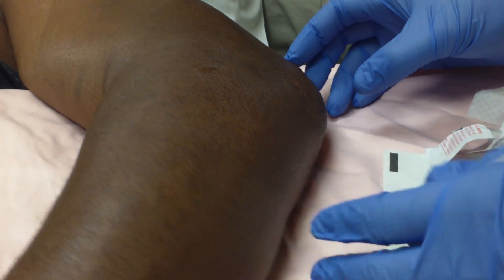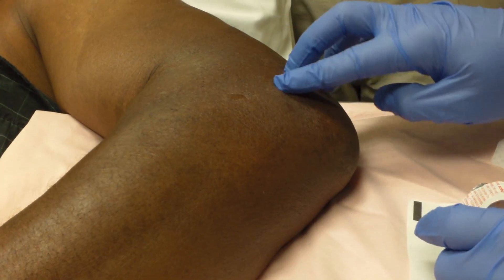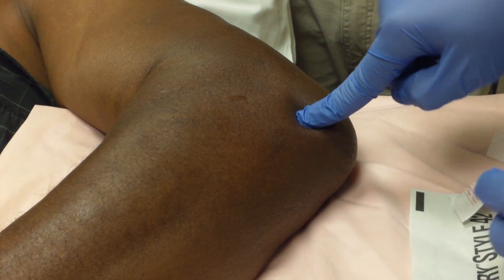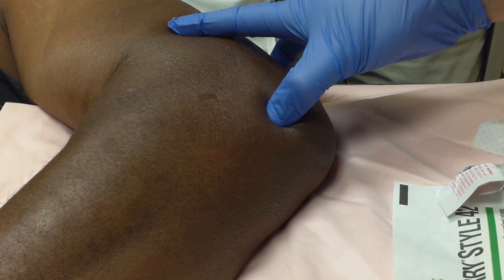What we're trying to do here is tap the elbow joint. This patient has presumptive gout, so we're trying to get some fluid to see the uric acid crystals. The landmark we're going at is the lateral epicondyle, going just distal to it. We're trying to get into the triangle between the lateral epicondyle, the radial, and the ulna — there's a little triangle where you can fit in, right at that spot.